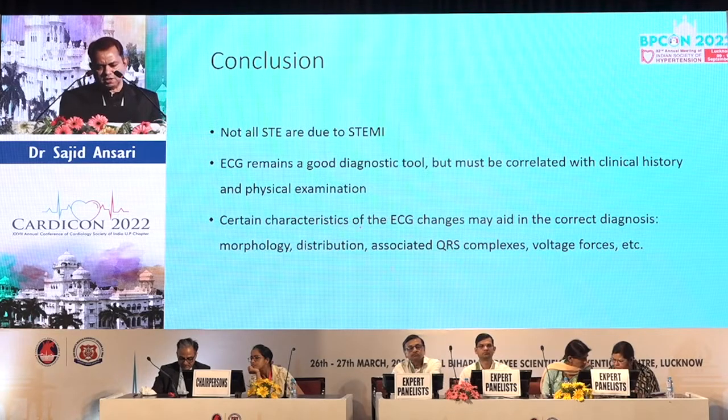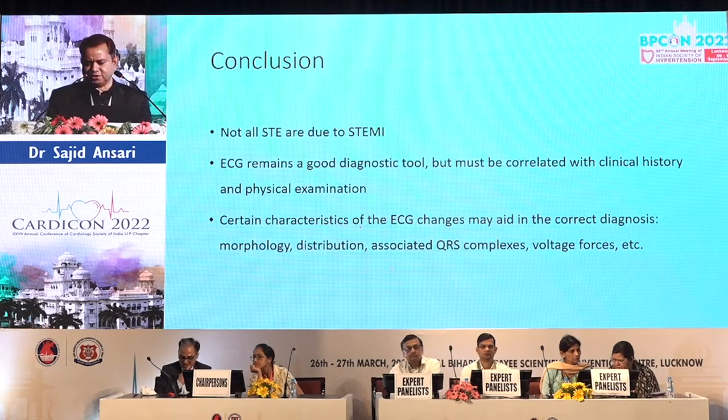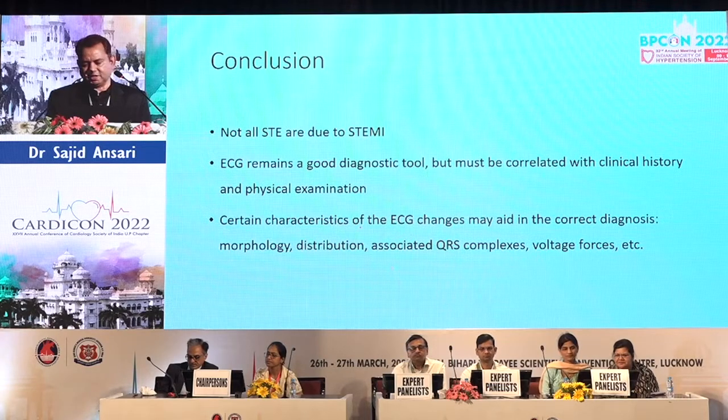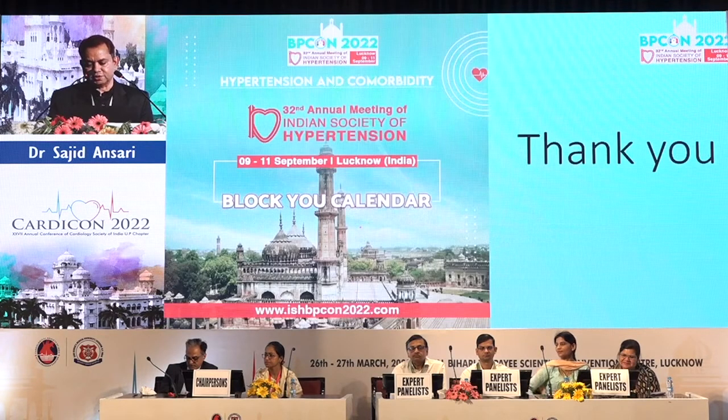So, in conclusion, not all ST segment elevation is due to ST elevation myocardial infarction. ECG remains a good diagnostic tool, but must be correlated with clinical history and physical examination. Certain characteristics of ECG changes may aid correct diagnosis: morphology, distribution, associated QRS complex, and the voltage forces.